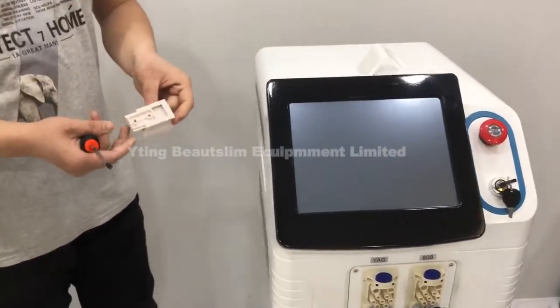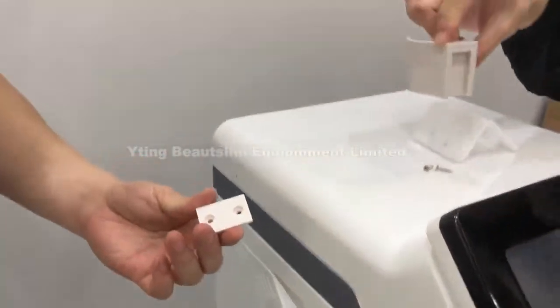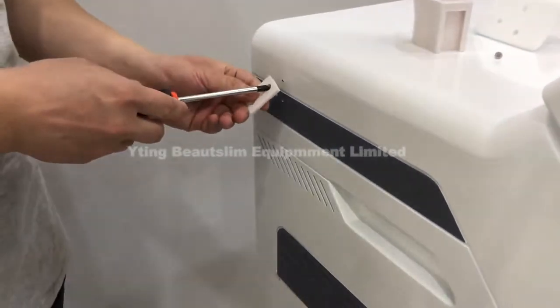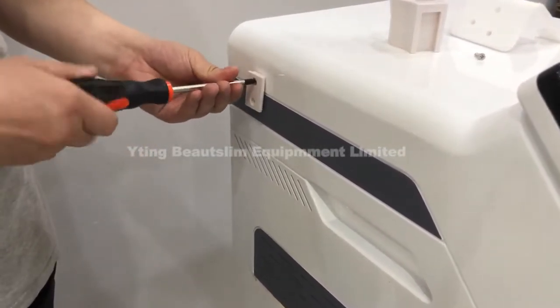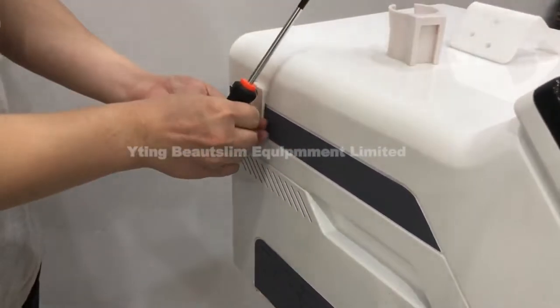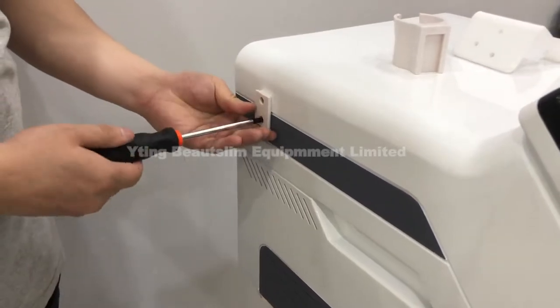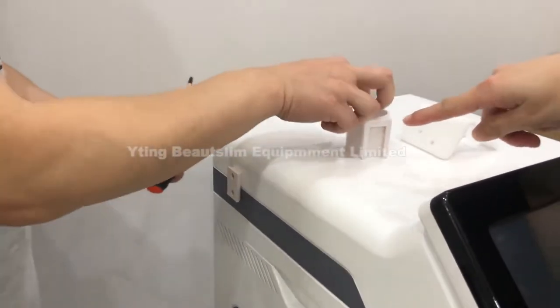Now we install the basket. Remove this part from the basket and put the screw on, then insert it into this part.